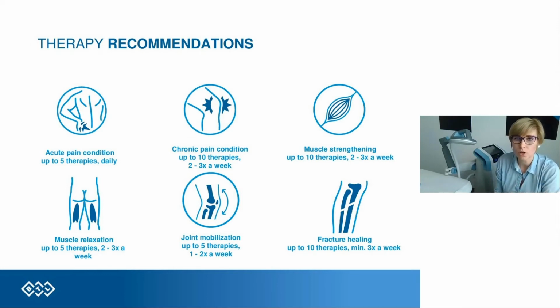Of course, this is the recommendation, and it is fully safe. Of course, in acute conditions, we use this daily. In chronic conditions, we use it 2-3 times per week. It is up to the goal we want to reach. If we want to strengthen the muscles, the muscle can be a little bit fatigued, so we should have some time for resting. And this is up to the patient, of course.